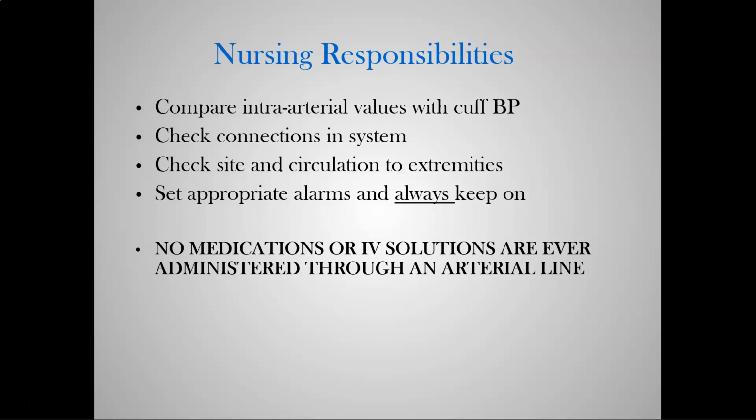I check my site, I check my circulation, I check for phlebitis, inflammation, swelling, redness, any discharge from insertion sites that could indicate infection. I'm looking at all this stuff. I'm making sure my bag doesn't run out of NS or heparin. I'm making sure my alarms aren't coinciding with what I'm monitoring.